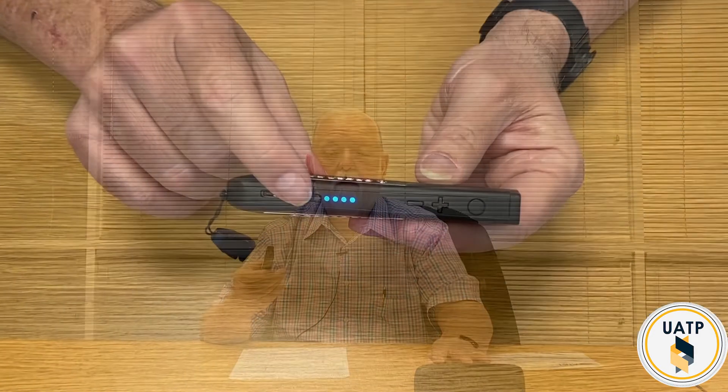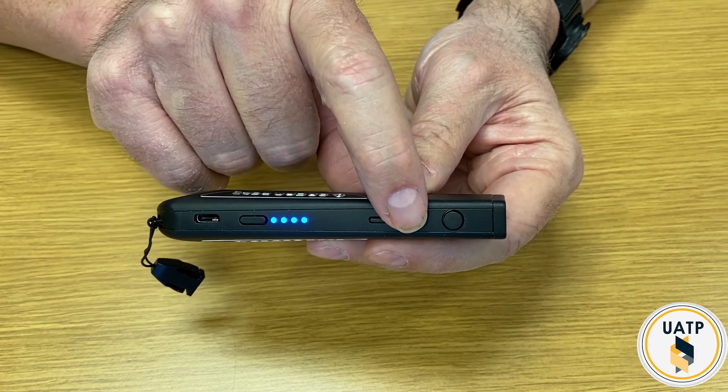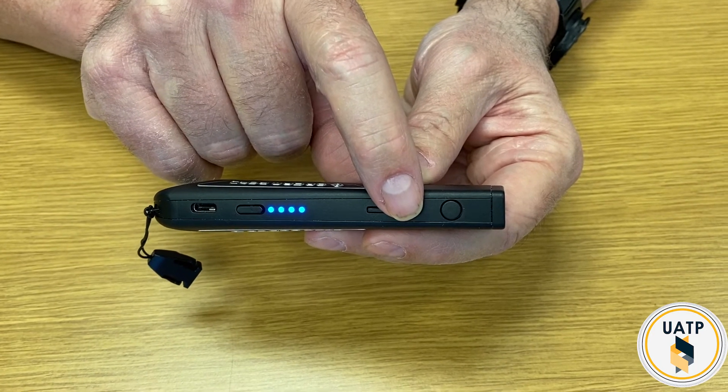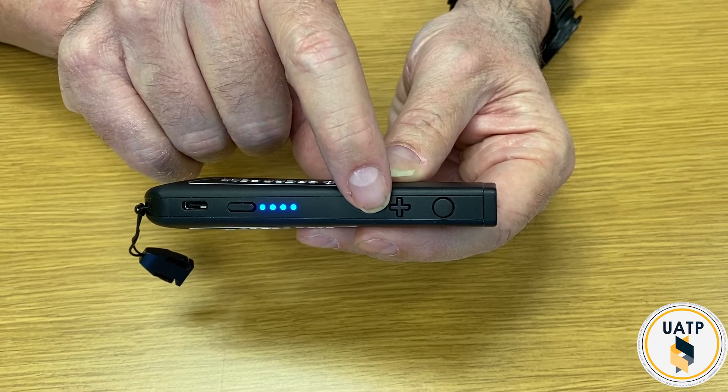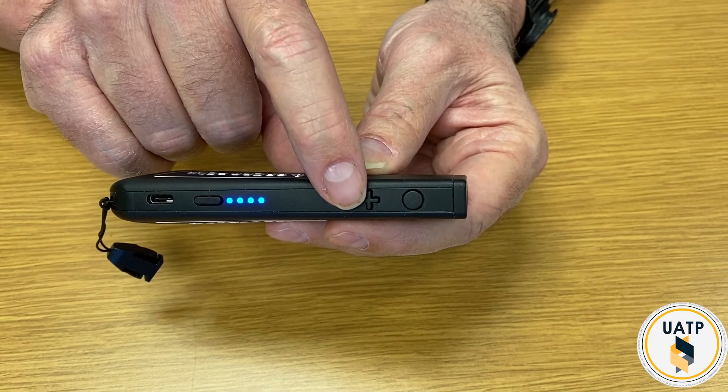This is a Bluetooth speaker I brought just because the volume on this device is not really loud — it's loud enough, but it might not be heard on the video. The power button is here. Moving this way, this is the minus button and the plus button, which can be used for volume. It's also used to navigate through documents and move through menu choices.